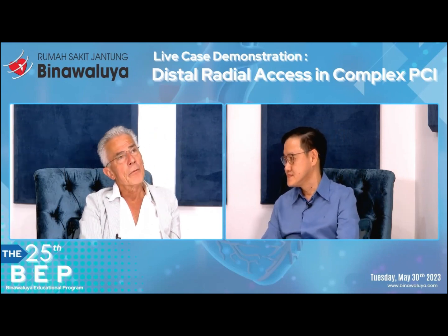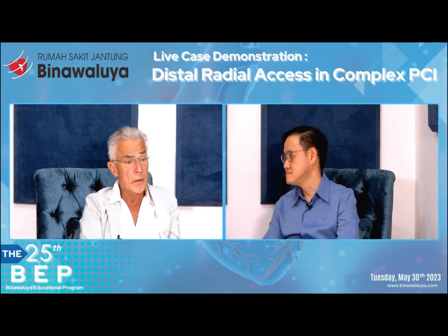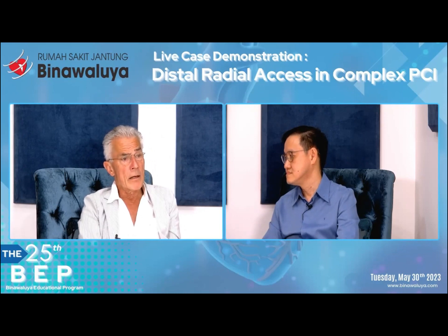change some products for easier access, just like in the old femoral days. We only had femoral needles and femoral sheaths, and later the materials became more refined. And today, I think everything is there to perform a safe and successful procedure. So that would be my recommendation. There's enough technology, there's enough knowledge, and there are enough training opportunities. So use them, and make that step, because I'm convinced that this will become the default strategy.